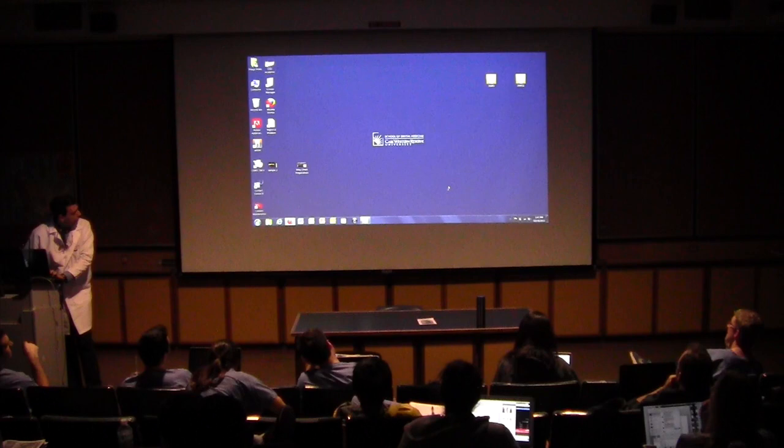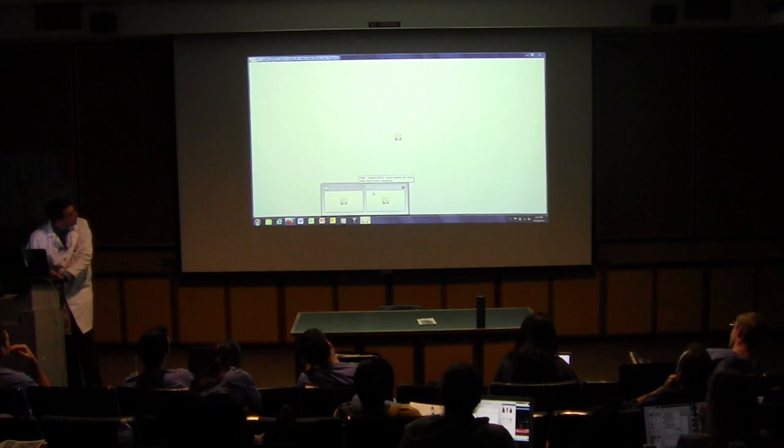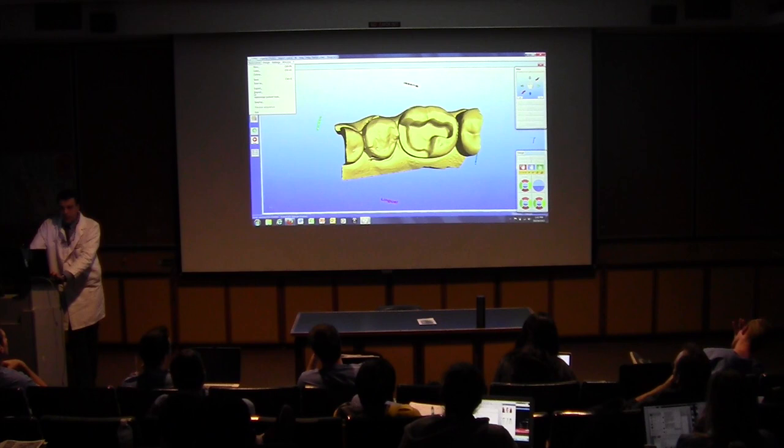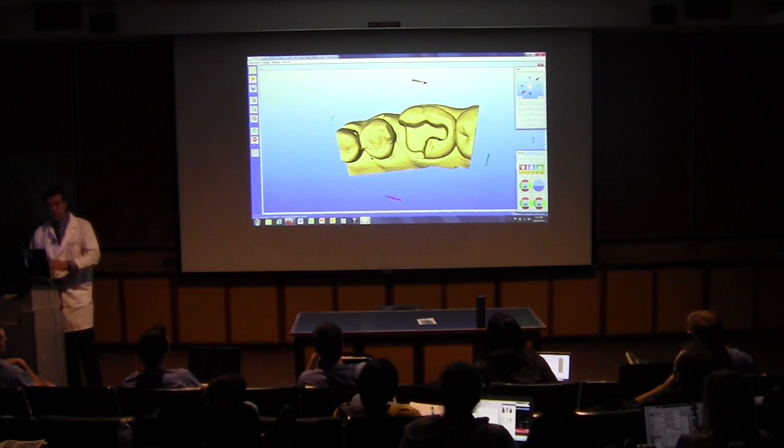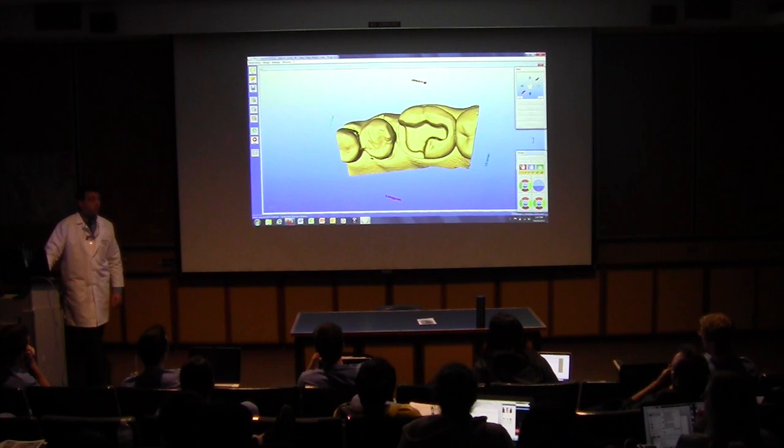Fire up your CEREC application. If you click here in restoration and import, select the file from the desktop, and you can open the file on the computer screen. So since the beginning, since project number one, project number two, three, and so on, you can now check all those preparations on your computer using the 3D.